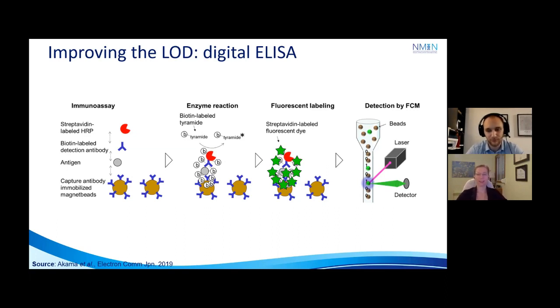Great, thank you. And then on that line, I'm curious. You're saying the goal is near complete automation of the process at the point of care. However, right now there's a 4-hour incubation period. Could you speak to what has to happen between where the process is now and where it needs to be for point of care? Okay, so yeah, at the moment I'm using very long incubation.